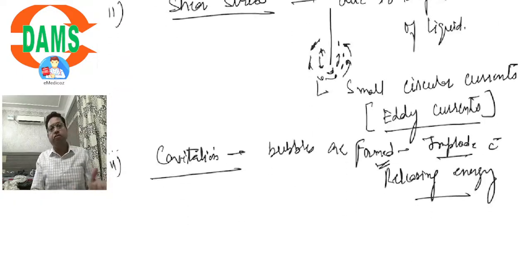These are the instruments which are principally used for endodontic treatment, starting from group 1, that is the hand instrument, till group 6, that is sonic and ultrasonic instruments. Okay, this is all about today's session.